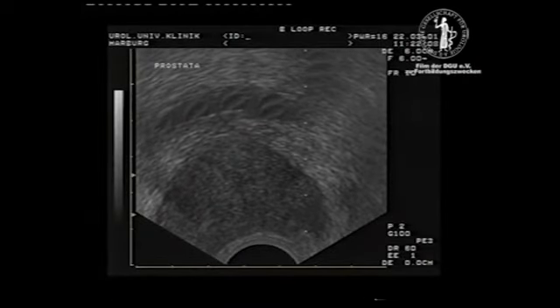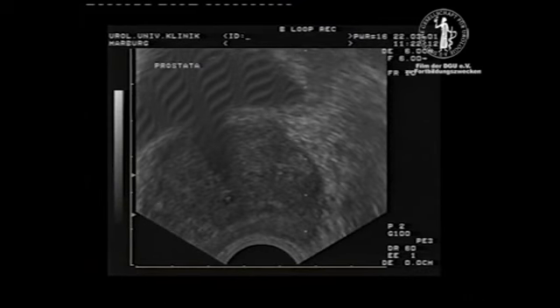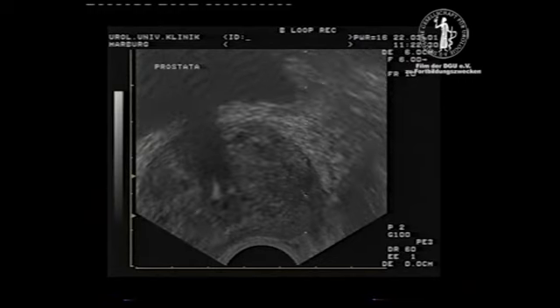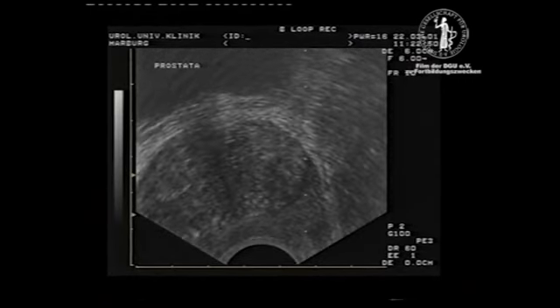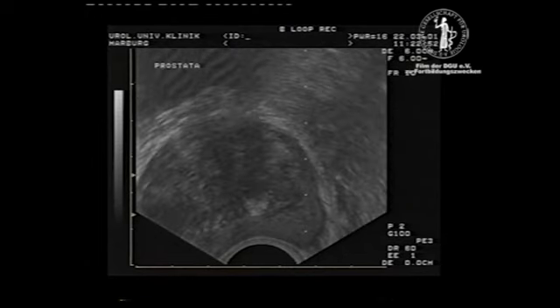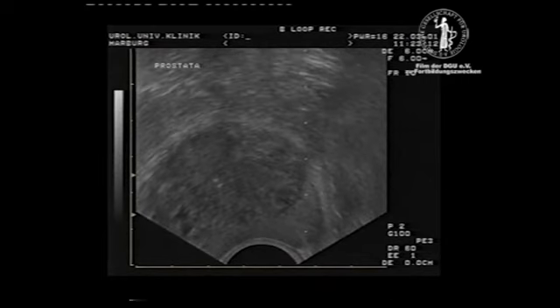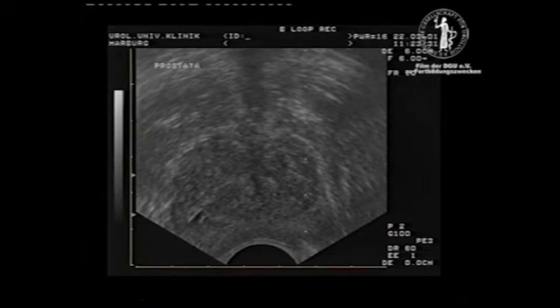Again, transrectal ultrasound control offers high precision in directing the needle to the peripheral zone of the prostate in both lobes. Even the needle advancing with high velocity into the prostate is displayed in real time. In this special case of a repeat biopsy of a large prostate, an additional transition zone biopsy core was taken from each lobe.